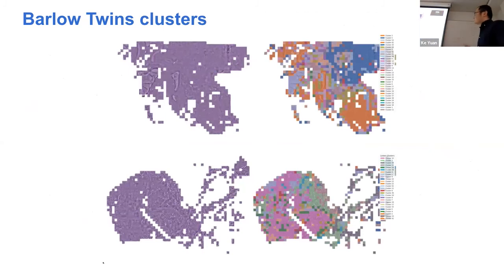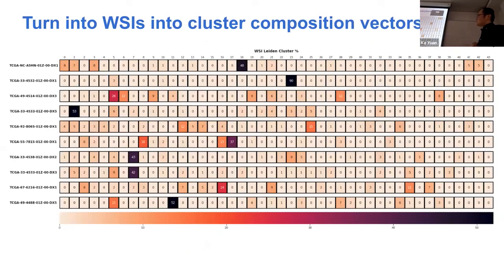Now this is an example where you can color code the original image with those clusters. We see this as an example to show the robustness of clusters, because if your clusters had lots of variability, you wouldn't see a large stretch of area being clustered into the same label. Here we see that. That gives us confidence to move on to the next step.